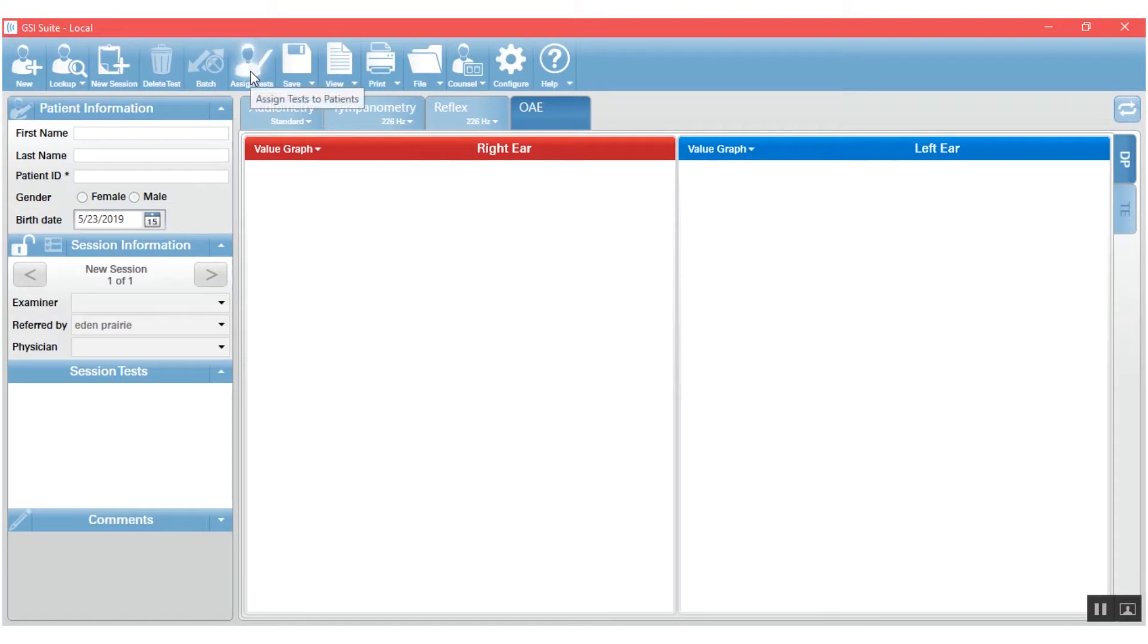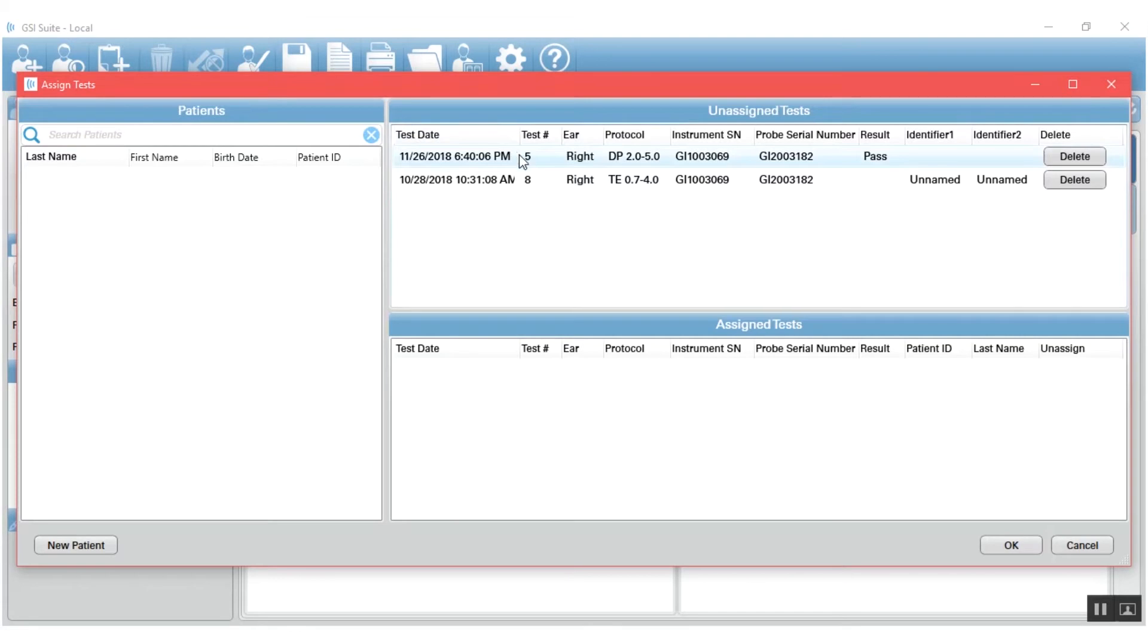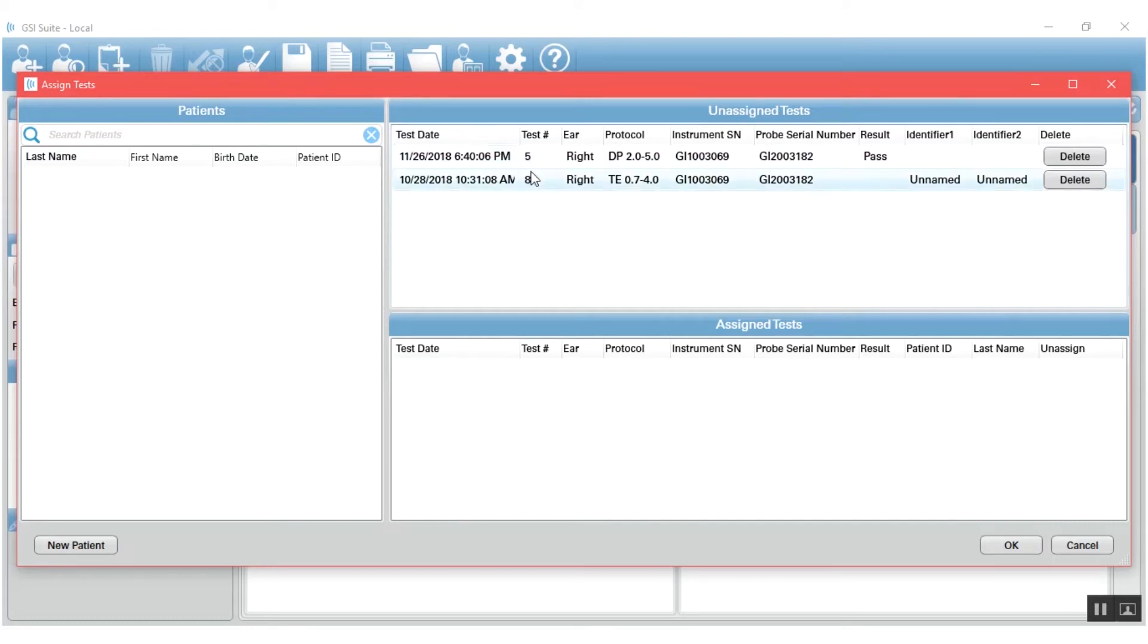You press OK and that brings you to the assigned test window. When the assigned test window is open, there are three main sections of this window. The first one that you'll notice is the unassigned tests. Every OAE result that was transferred in will be dumped into the unassigned test area.